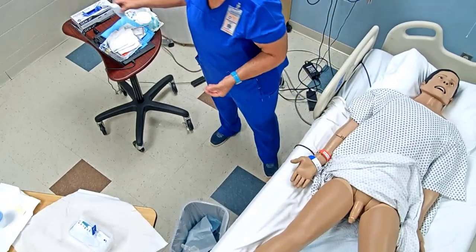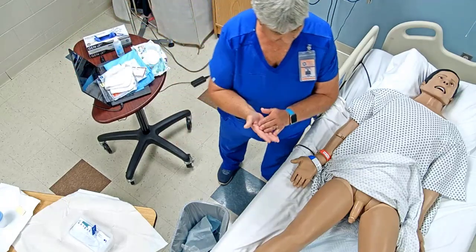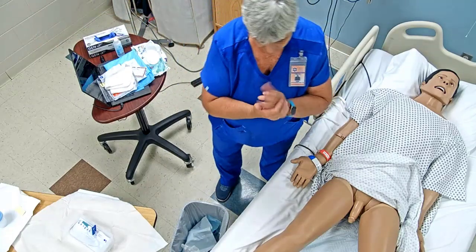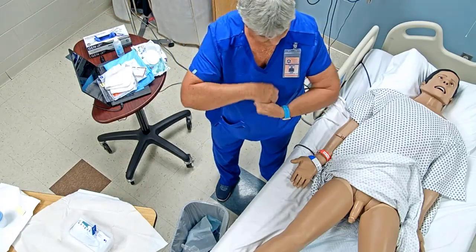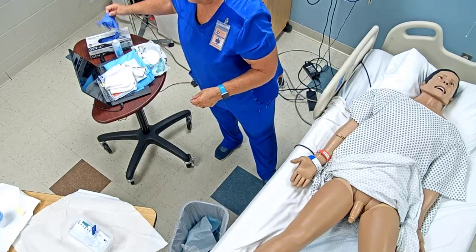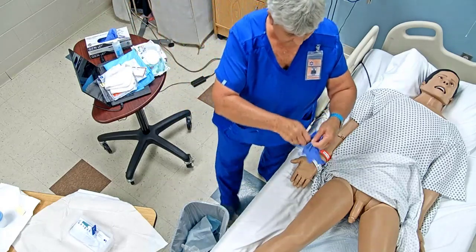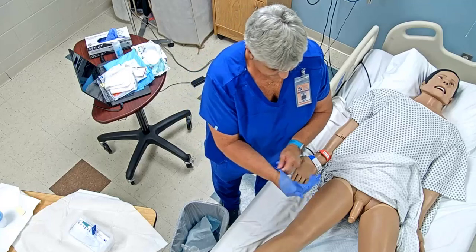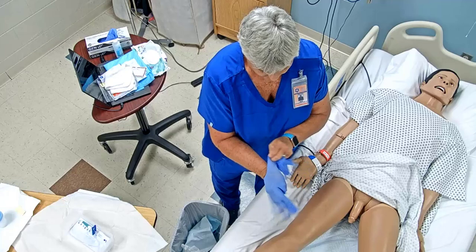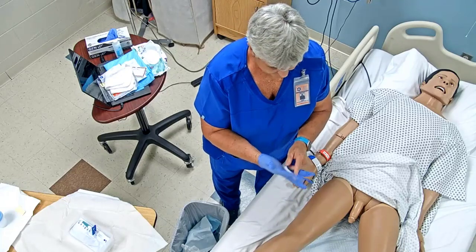Of course, your medical hand wash is on the wall. Rub that in till it's good. Put on some clean gloves. Now this time your hands are getting sticky.